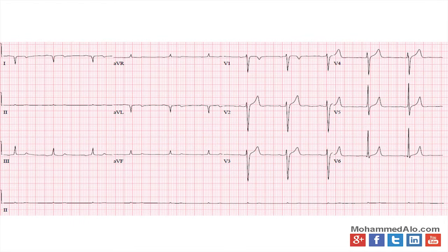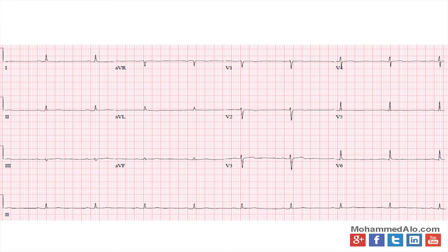Here's another one. A little bit on the bradycardic side, you do see P waves. Every QRS has a P wave. Very low voltage in the limb leads, 2 especially. You got lead 1 down, lead 2 upright. You could argue that this is right axis deviation. You got AVF to double check, so it is right axis deviation. Next one, very bradycardic, very low amplitude. Once again, you got to be thinking effusions. Pneumothorax, anything that puts water or air between the heart and the anterior chest wall.